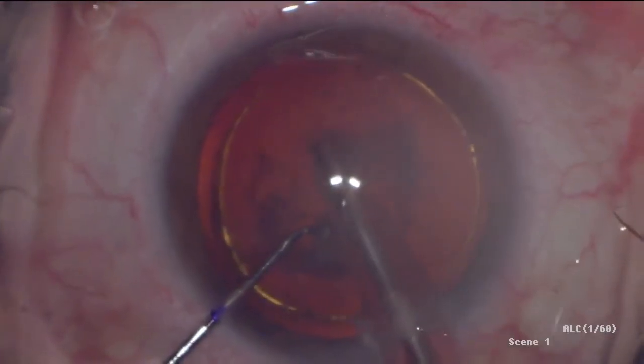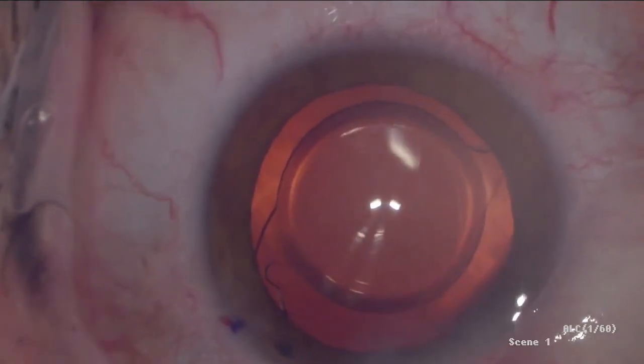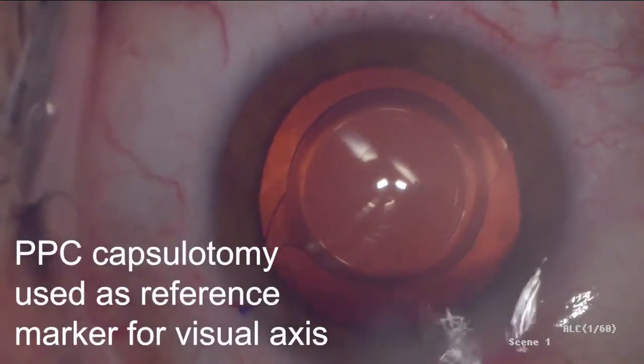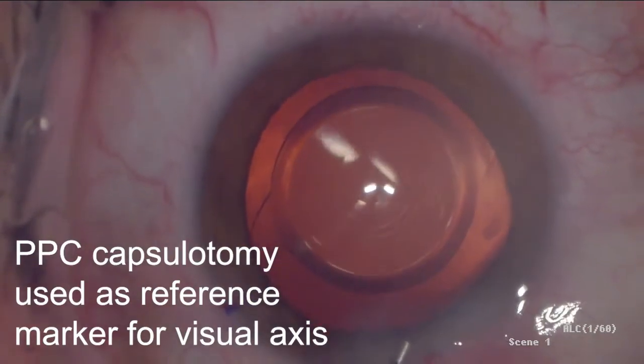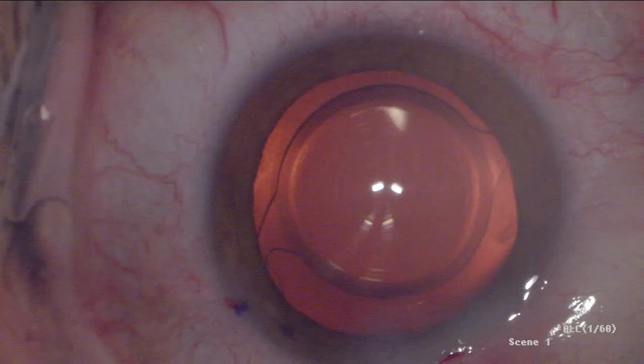Hydrodissection and phacoemulsification were performed. The IOL was positioned to achieve 360 degrees even overlap with the visually centered PPC capsulotomy as the reference marker.